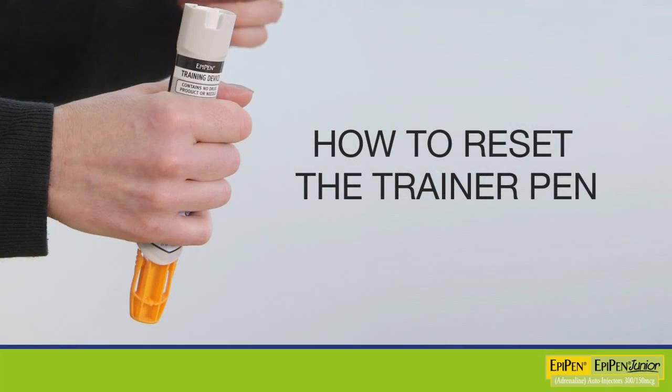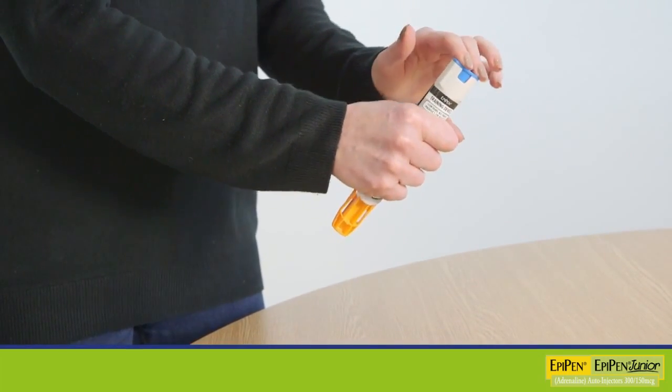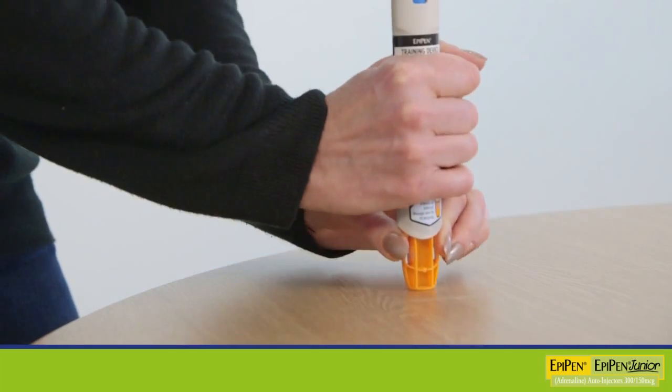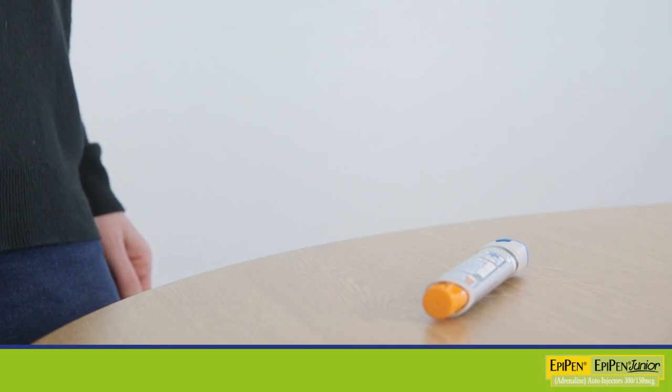To practice again, the trainer pen must be reset. To reset the trainer pen, replace the blue safety cap, place the orange tip on a hard surface, squeeze the sides of the tip, and push down.